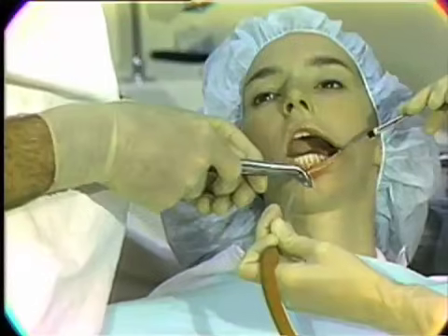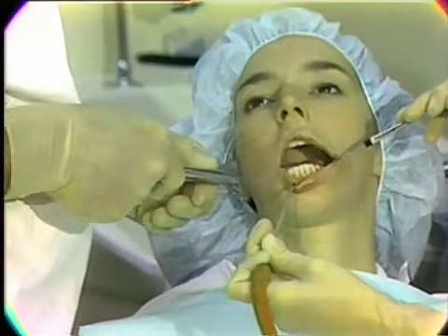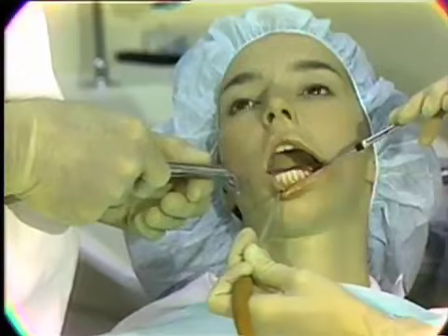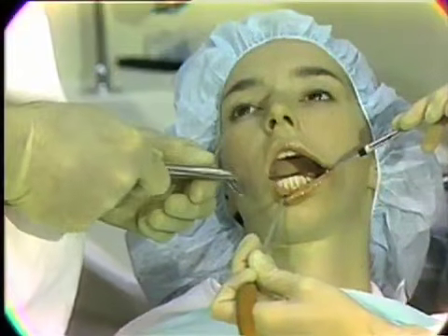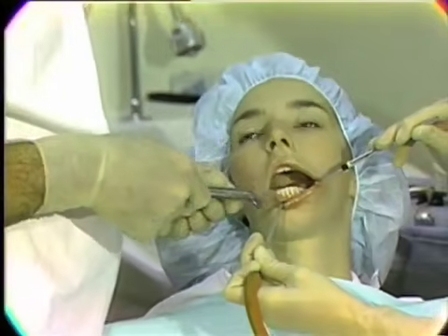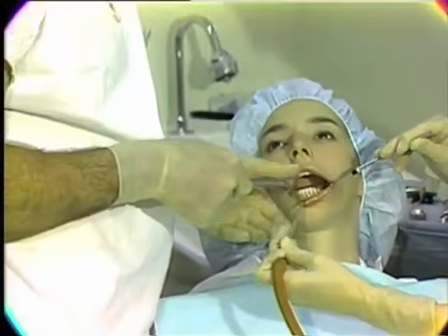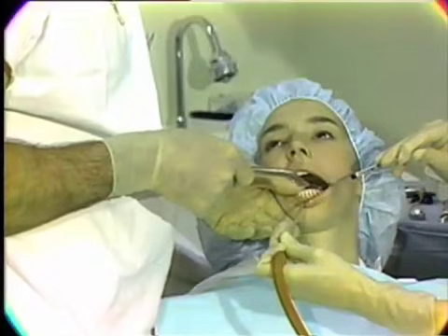Teeth tend to be resistant to mobilization, and as you start the mobilization, it requires a good deal of force. As the tooth begins to luxate, you use less and less force until, again, at the time the tooth is ready to deliver, it is just literally lifted out of the socket after you have it sufficiently mobilized.